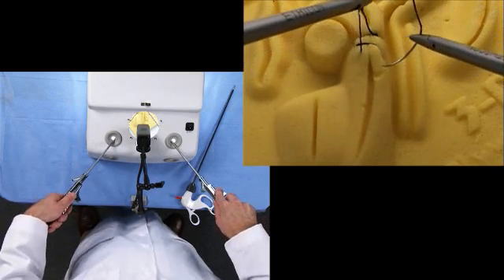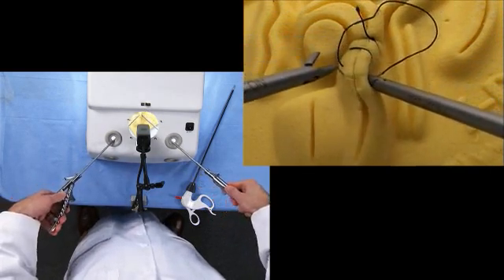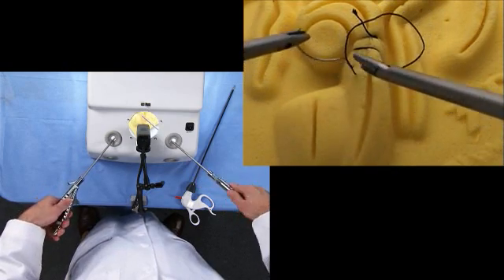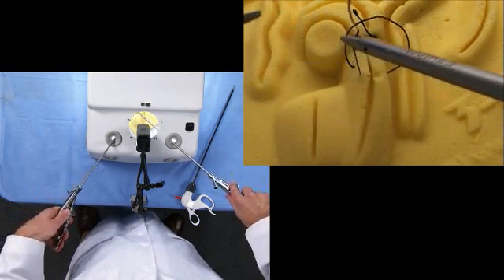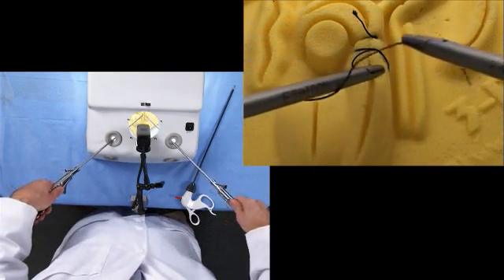Again, assisting with our left hand. Grab right behind the swedge. Pull this down. Now we'll do our wraps again.